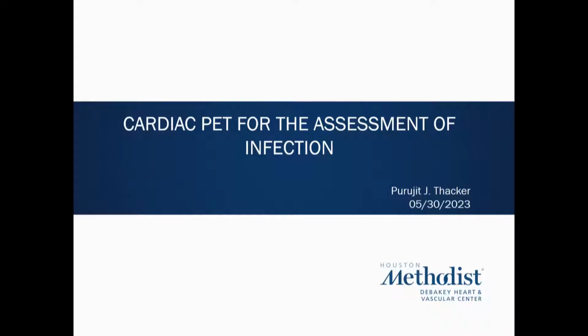So I'll do my best to get us through today's topic, which is cardiac PET for the assessment of infection. One of the reasons I picked this topic is because PET is a burgeoning subspecialty of cardiovascular imaging, and as of now, this is one of the less broadly known applications of PET, especially from a cardiologist's perspective.